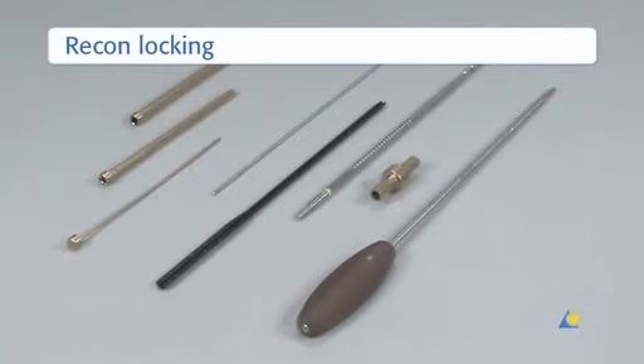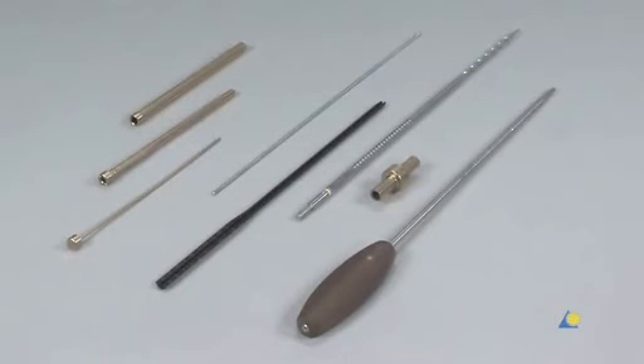To insert the recon locking screws, the following instruments are needed: the 11.5mm/8.5mm protection sleeve, the 8.5mm/3.2mm drill sleeve, the 3.2mm trocar, the 3.2mm guide wire, the direct measuring device, the 4.5mm/6.5mm reamer, the fixation sleeve, and the T25 star drive screwdriver.